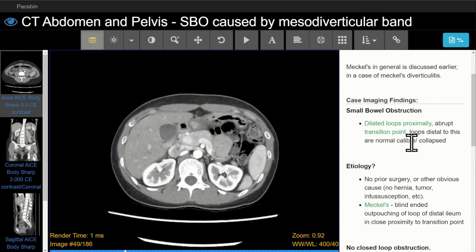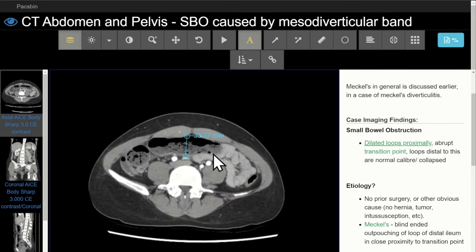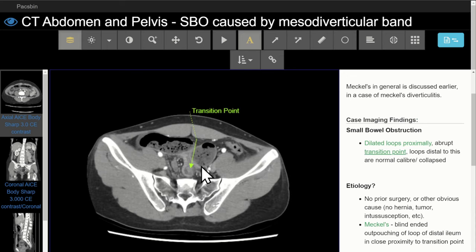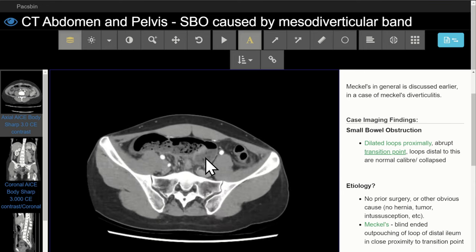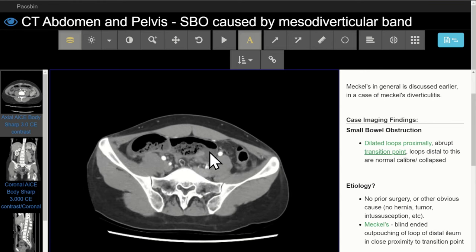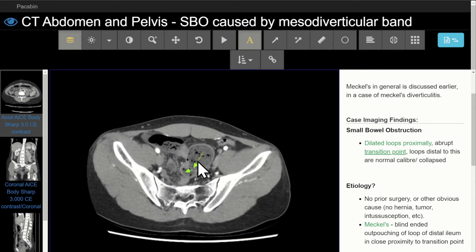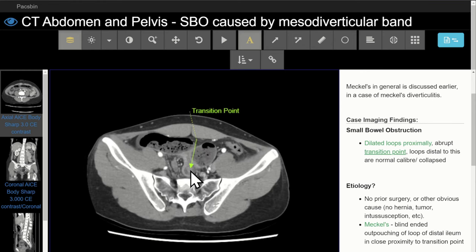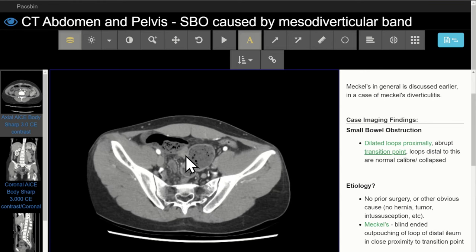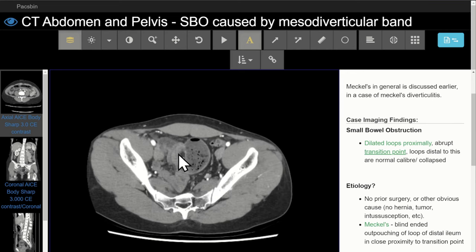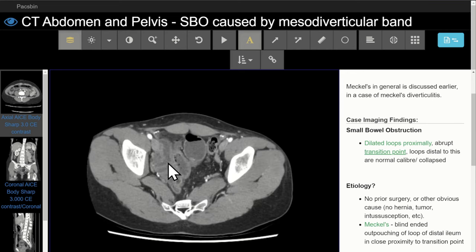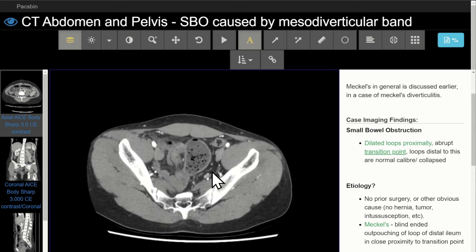First, is there a small bowel obstruction? Again, we have dilated loops of small bowel proximally up to 3.3 centimeters. We have an abrupt transition point indicated here — you can see dilated loops proximally, the bowel turns this corner, the bowel loop remains dilated, with arrows indicating the direction of flow from proximal to distal. Then as it turns this corner, we have a transition point and the small bowel is now completely collapsed, normal caliber. The findings are in keeping with a small bowel obstruction.